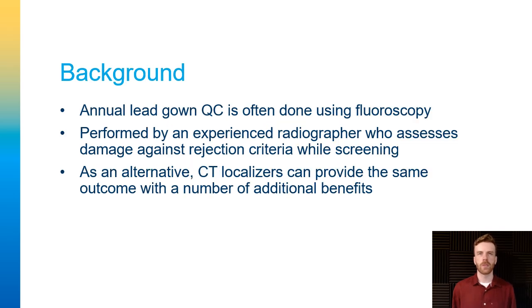In many hospital imaging departments, annual lead gown quality control is performed using fluoroscopic imaging. And it's often performed by a radiographer who makes judgments on the condition of the gown while screening it. CT localizers can provide the same damage detection outcome with a number of additional benefits.